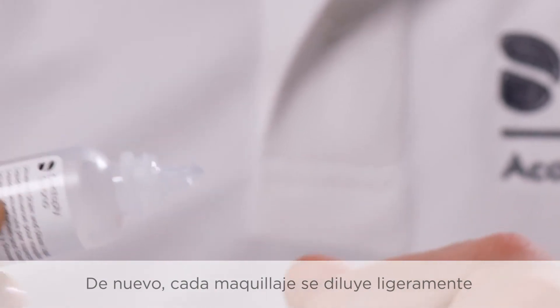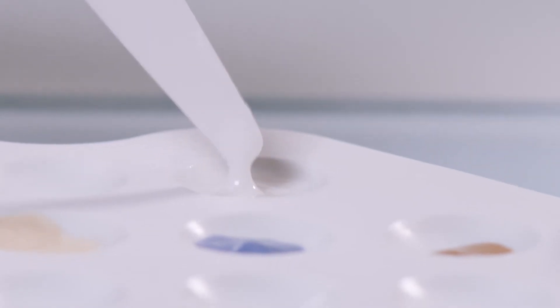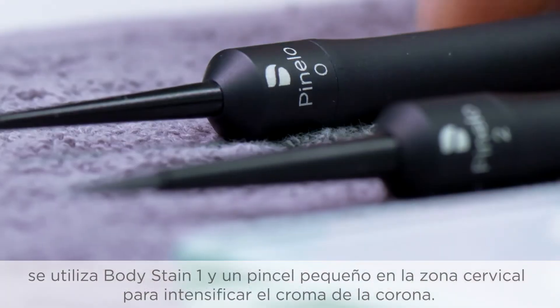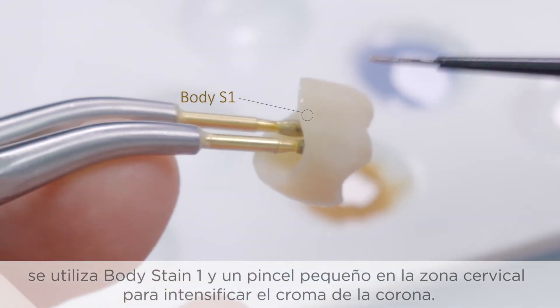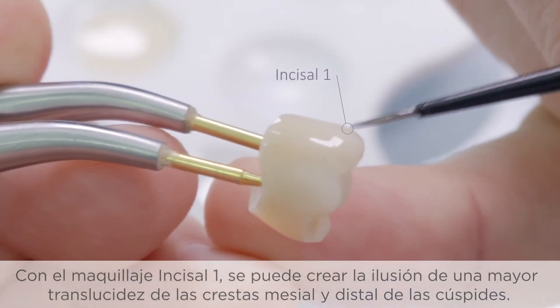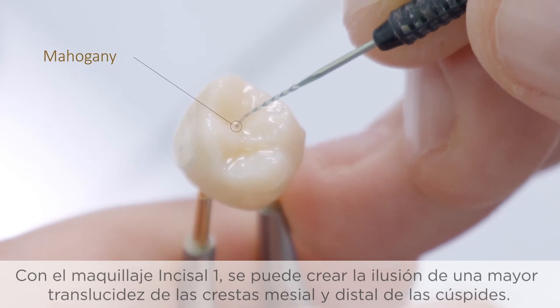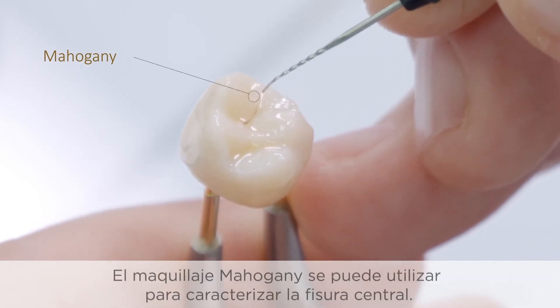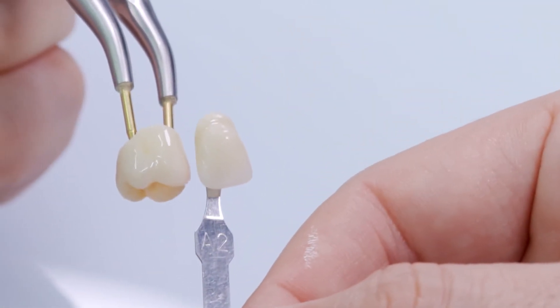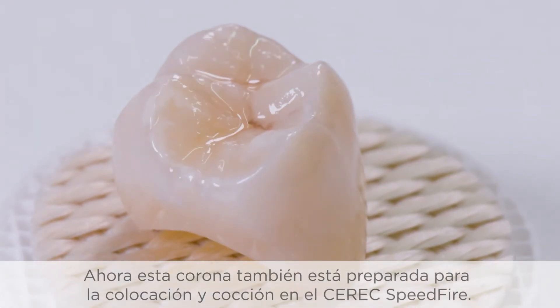Again, each stain is first slightly diluted by adding stain liquid to bring it to a homogenous consistency. After applying the glazing material in paste form, body stain 1 and a small brush are used in the cervical area to intensify the chroma of the crown. With stain incisal 1, the illusion of increased translucency of the mesial and distal ridges of the cusps can be suggested. Stain mahogany can be used to characterize the central fissure. The crown is now also prepared for placement and firing in the Seric Speedfire.